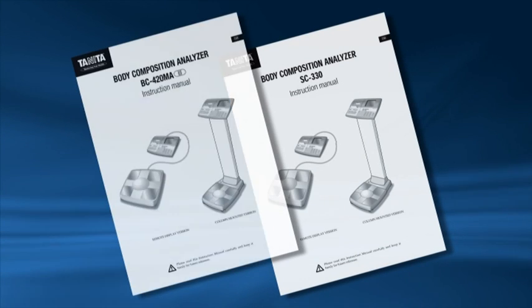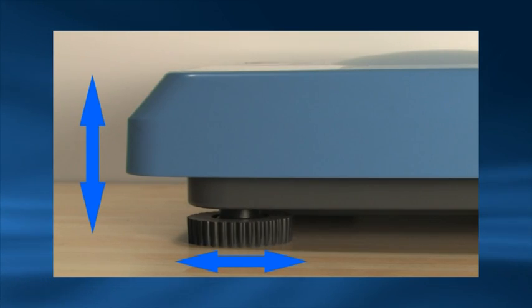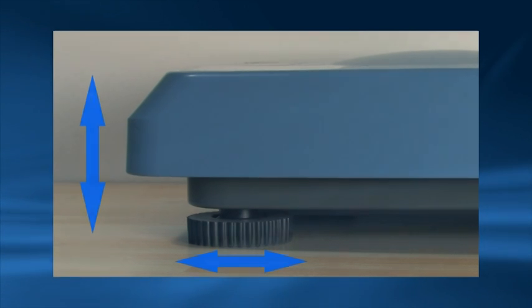Unpack all the items from the packaging. It is important you read the instruction manual, taking special note of the safety instructions before using the equipment. Ensure the weighing platform is placed on a hard, stable surface. Use the adjustable feet to level the platform. The BC420MA has a level gauge on the platform.